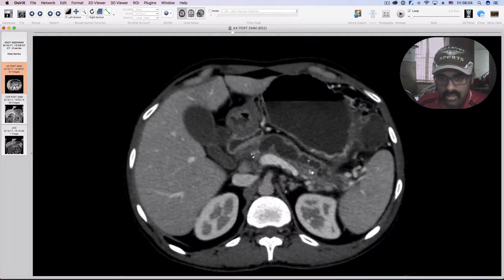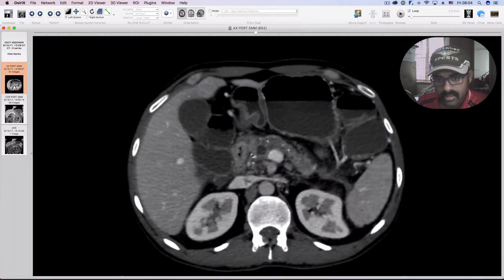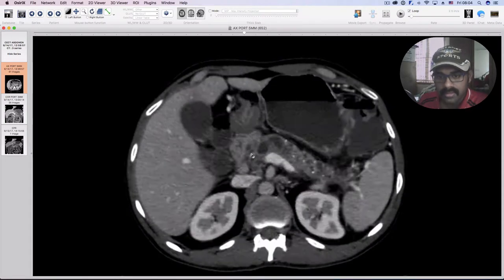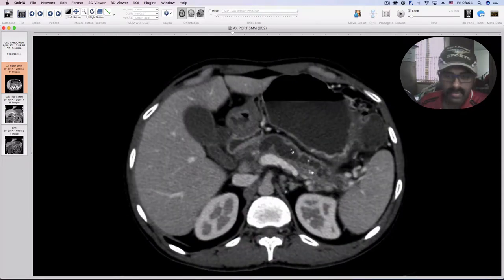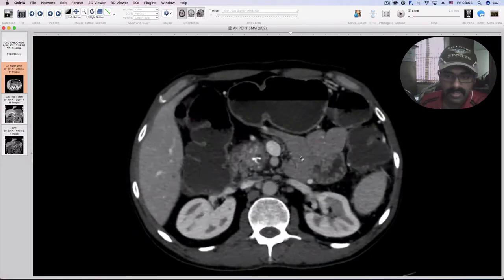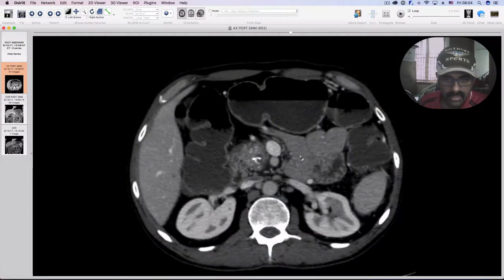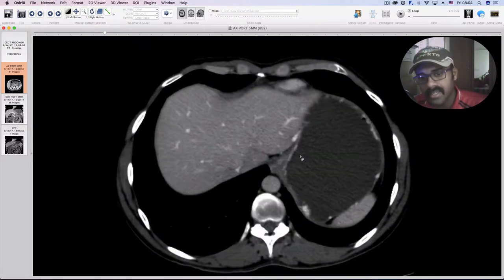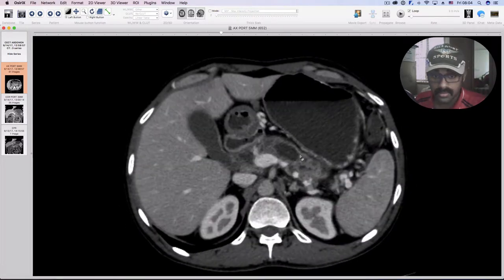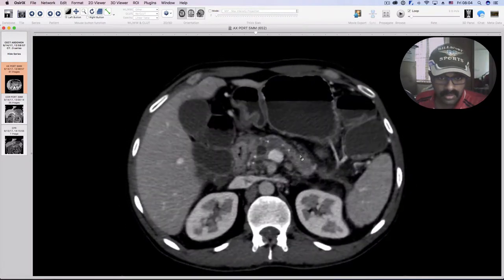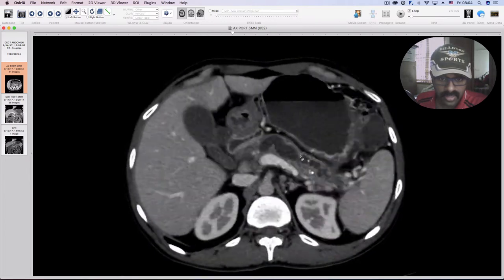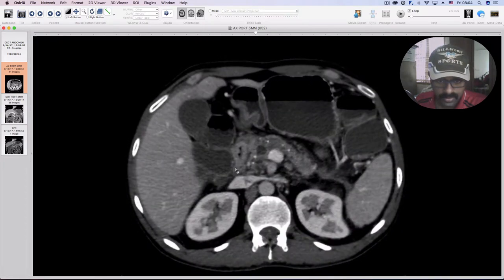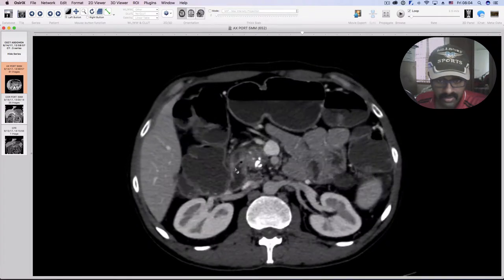There are multiple parenchymal calcifications. There is cystic dilatation of the main pancreatic duct and generalized atrophy of the body and tail of the pancreas. There is no intrahepatic biliary radical dilatation. The cystic duct and CBD are normal.